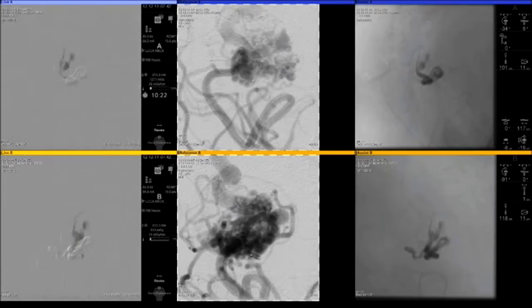The ideal pedicle that we picked, as an important aspect of this decision making, is a pedicle that is as straight as possible, as well as with the least amount of branching vessels, so that you can allow yourself to have reflux.